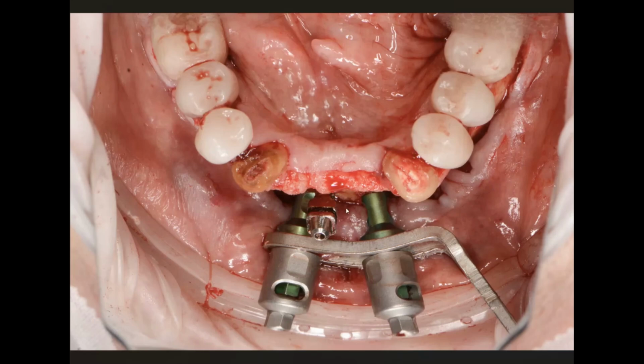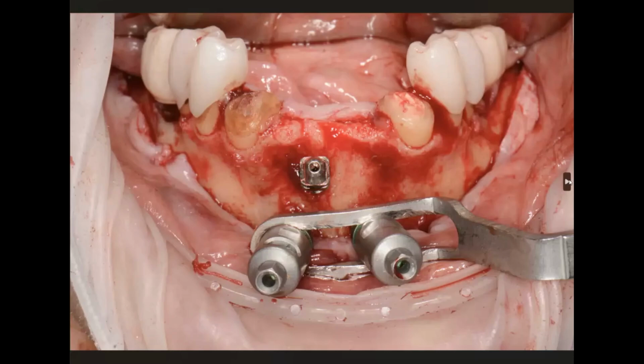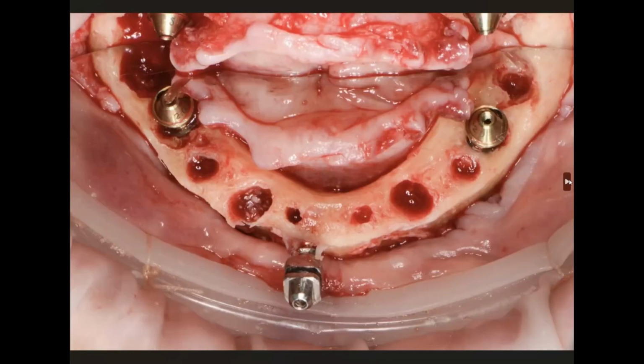You can see what I've done is I've placed it in the chin. This is in the symphysis, in the mandibular symphysis. So the main fiducial is below the top of the mental trigone, and then the tracker arm is below that. This is standard protocol that I do every day. Here it is from the front. Okay, so we got that aligned.